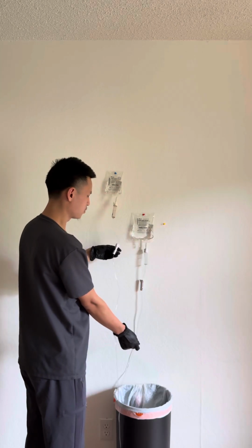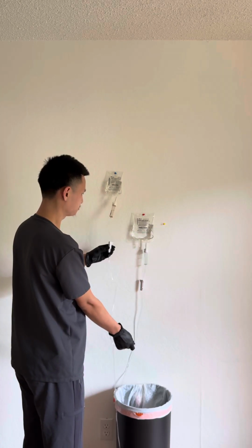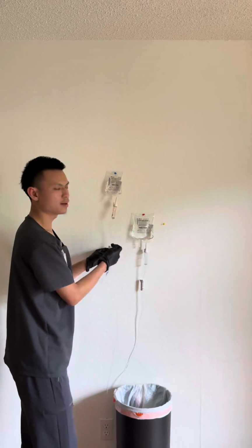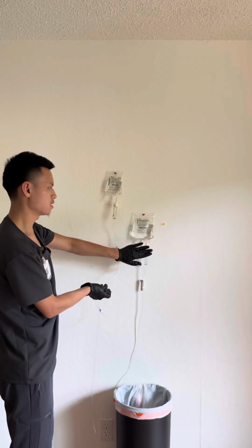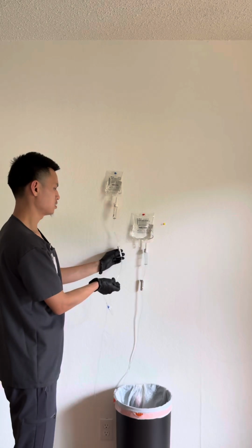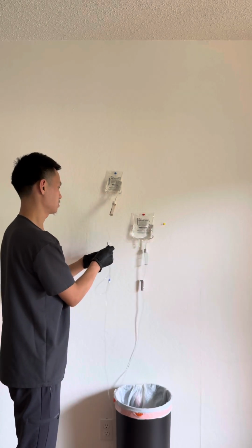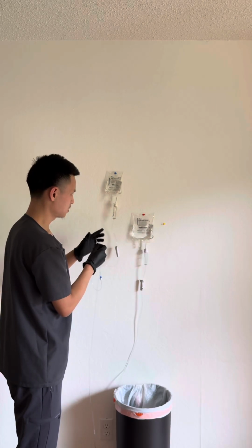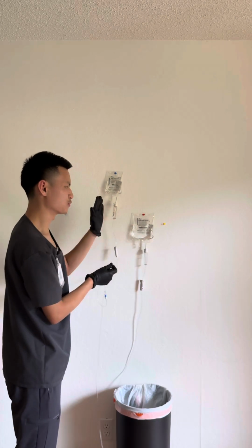Once that's primed, I will roll it back to the off position. While I'm doing this, my fluid is held, so it's in the off position. Now I am going to resume the fluids.